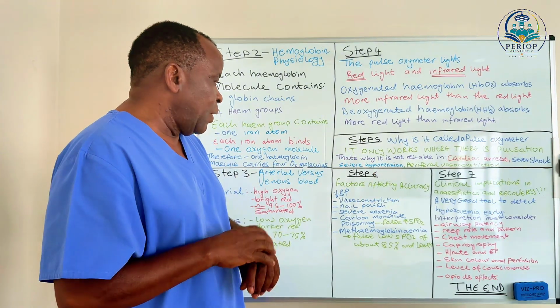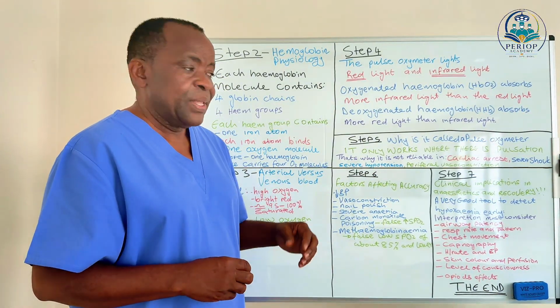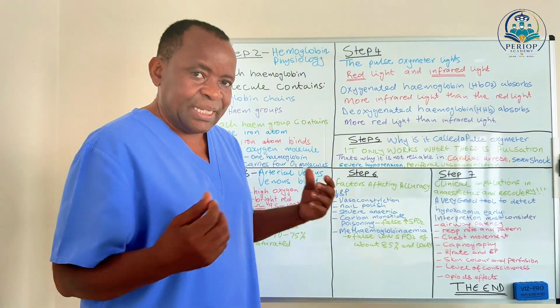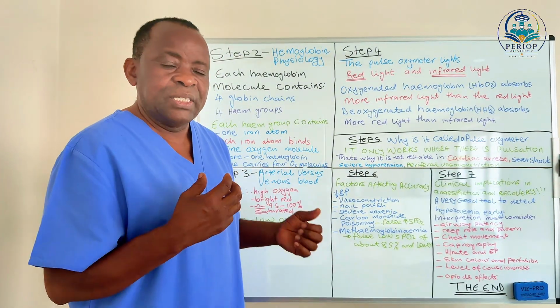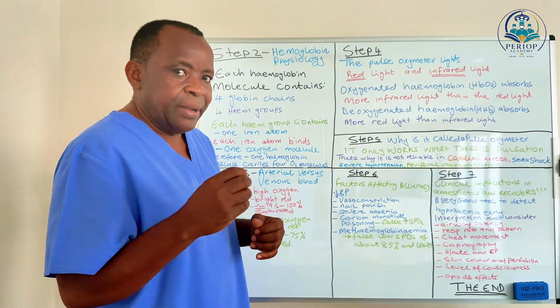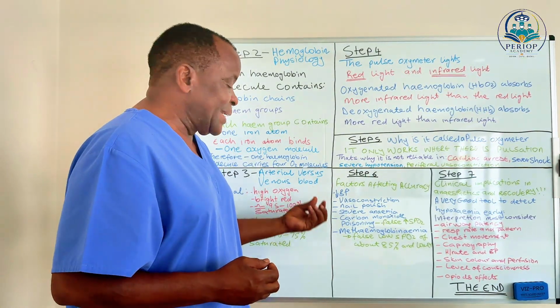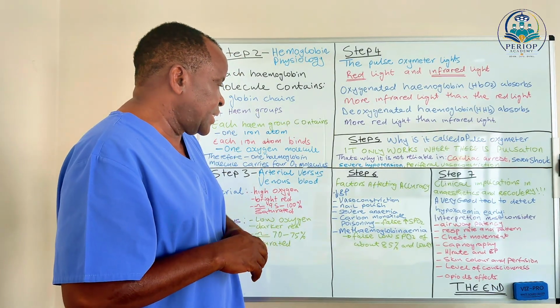Like we indicated earlier on, with hypotension, low blood pressure, the efficiency of this gadget in that situation is low, for the same fact that there is peripheral shutdown, the blood is being redirected elsewhere, and pulsation is minimized. Until we correct that, you can still get the values, but the accuracy is compromised in that situation.